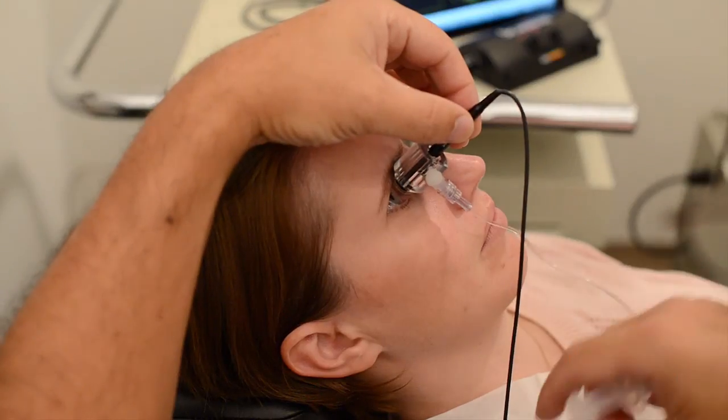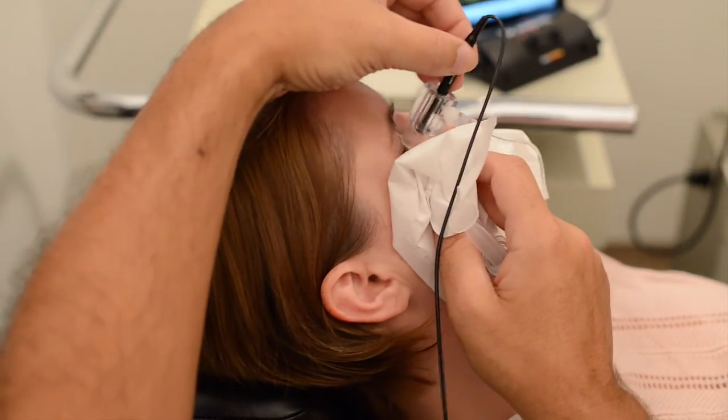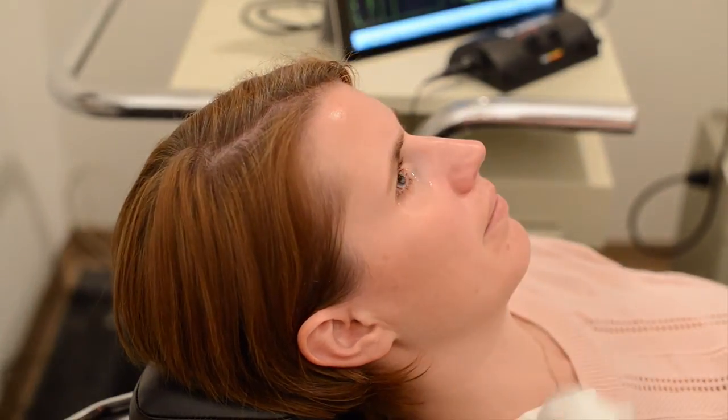When you're finished, have the patient look straight ahead. Lift their upper eyelid, pivot the shell downward, releasing the saline, gently pull the shell away, and use the towel to absorb any excess water.